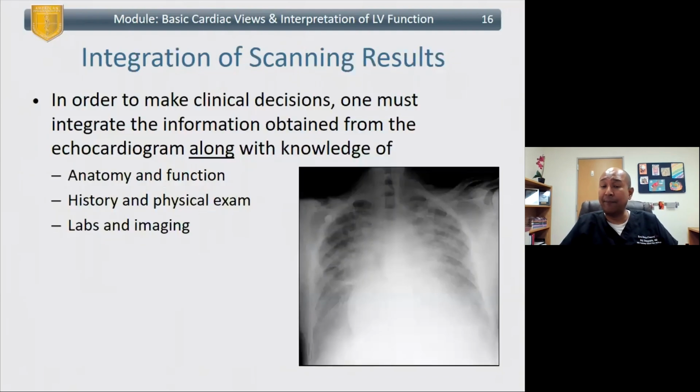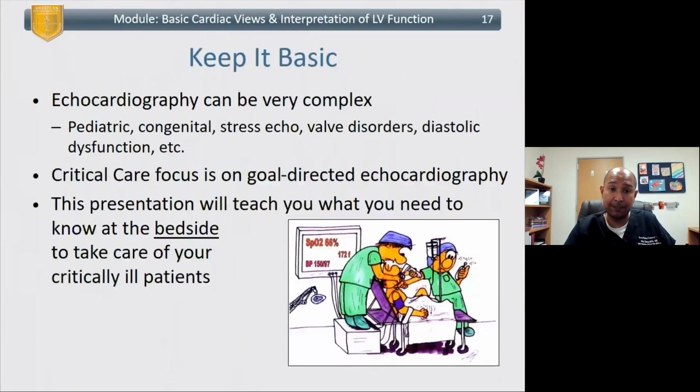So a key thing I mentioned already is that you want to integrate the x-rays, the labs, the physical examination, along with the echo to make the best clinical decision of what to do with your patient. So when you're taking a board question, keep it simple, keep it basic.